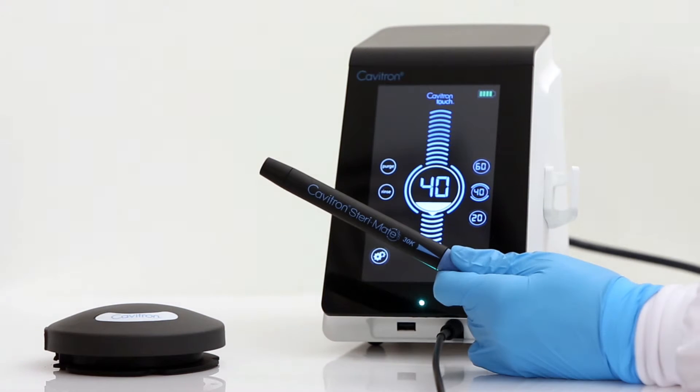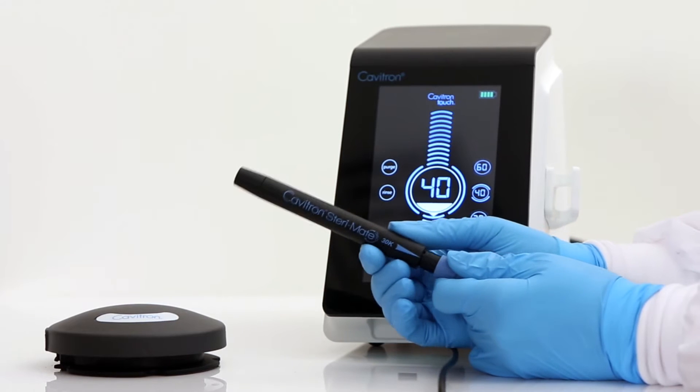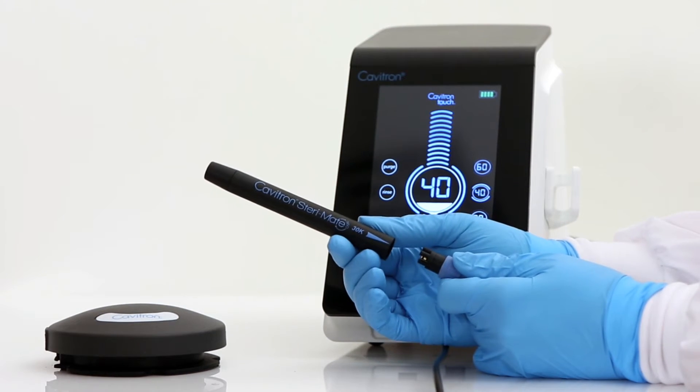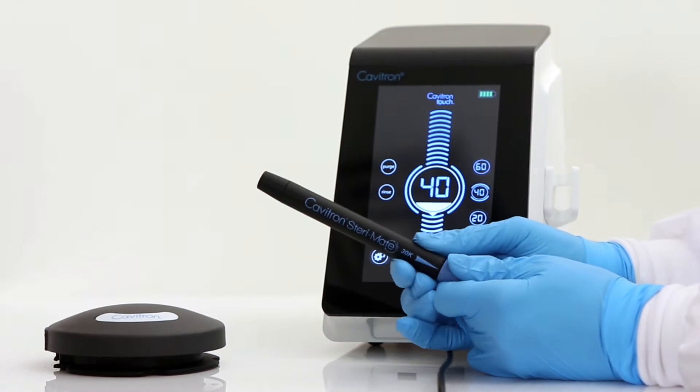If the cable assembly does not seat into the handpiece, gently rotate the handpiece until the contacts align and then fully insert the handpiece.